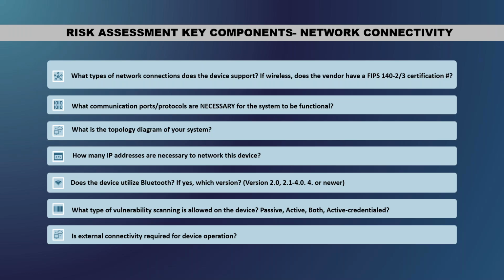And then the communication. I always ask what's necessary. I had one vendor ask me, I need to open 30,000 ports out to the cloud. And I said, okay, why? And they said, for patching. And I said, okay, that doesn't make any sense. So some things you need to probe them on is what's the communication, what's necessary for function, not nice to have, what's necessary for it to be in there. That will improve the risk posture of your system itself.